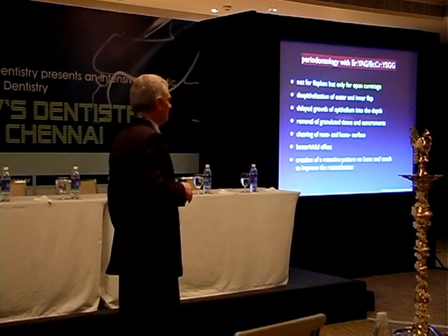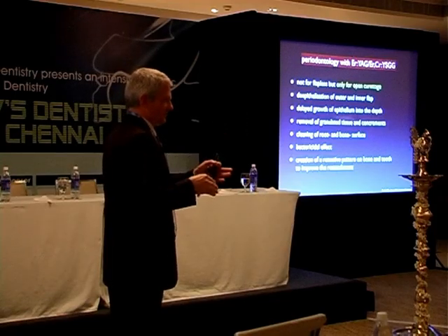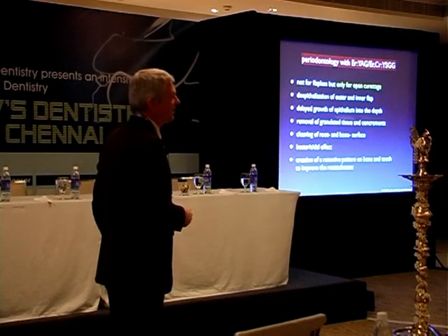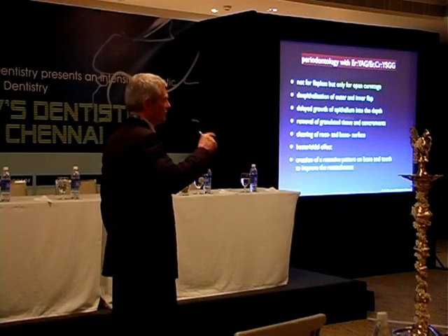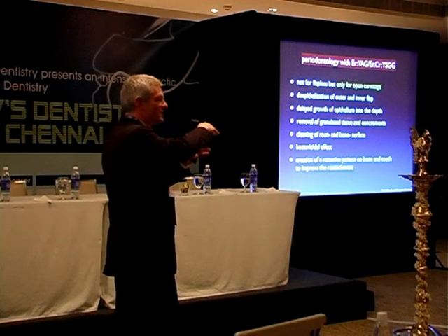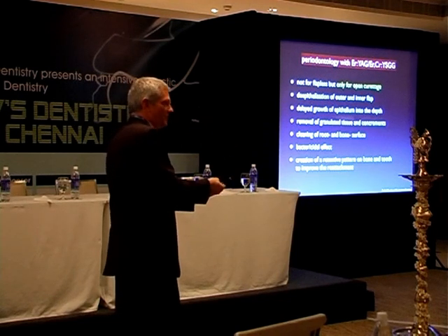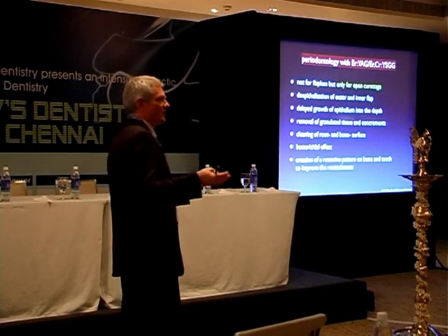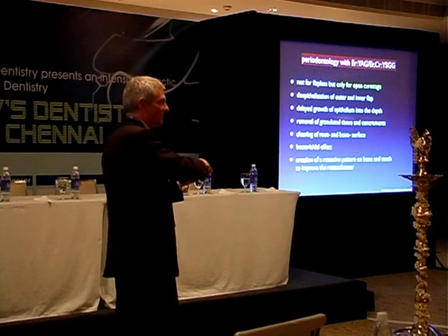Even if the canal is obturated in some parts, you mustn't use the laser fiber, because it may break, and it's very, very hard to get the broken piece out of the canal. Now you have to put it up to 1 millimeter before the apex, because otherwise you have not sufficient energy in the apical third of the root. So you have no effect of the laser in that part. So you always have to go up to 1 millimeter before the apex.